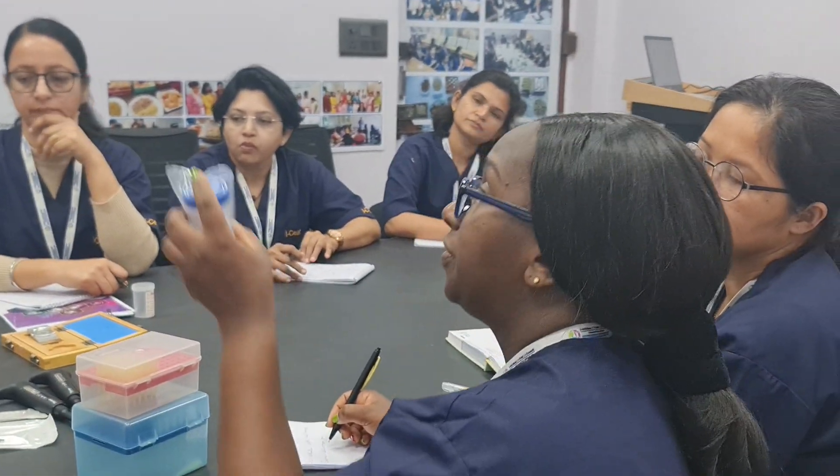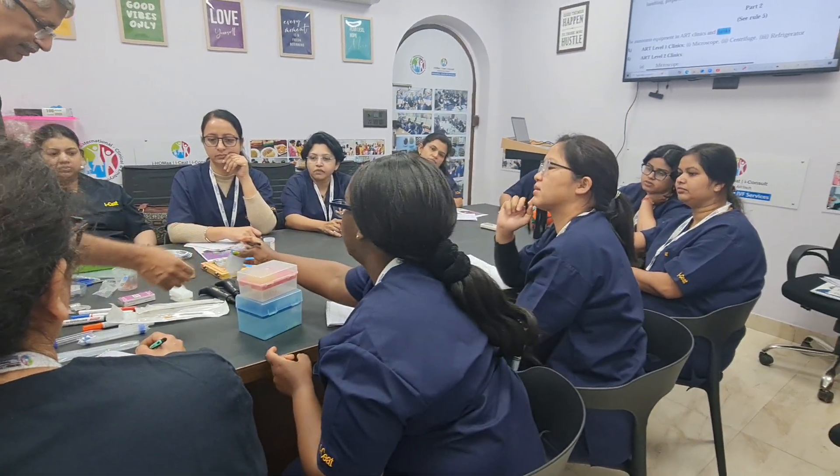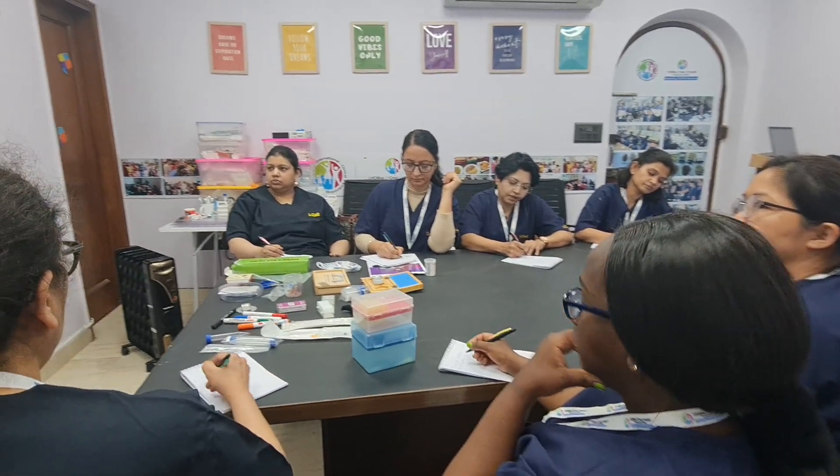Then we need 50ml. Then we need glass slides and cover slips. Normally we use two glass slides and two cover slips — one pre-wash and one post-wash.